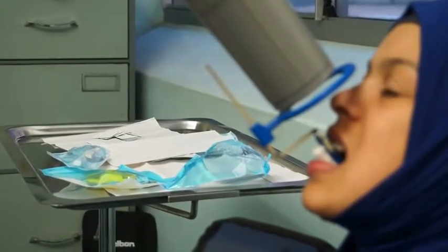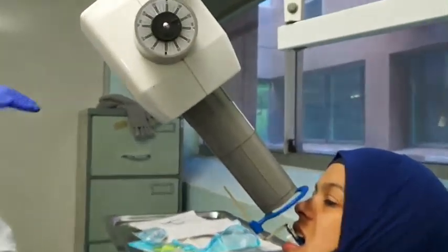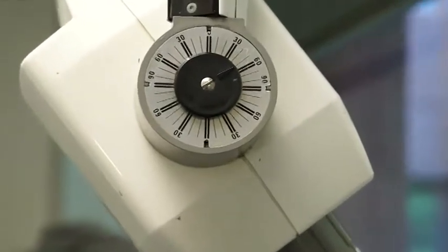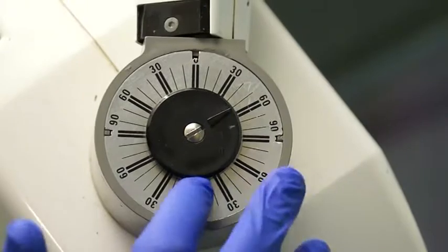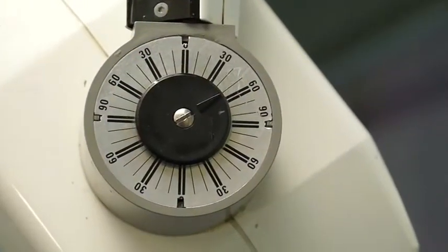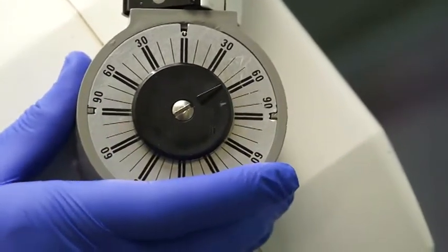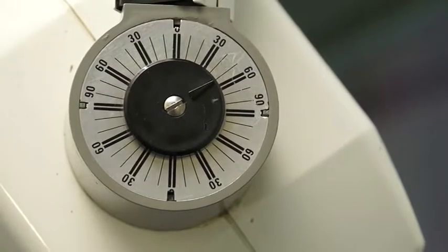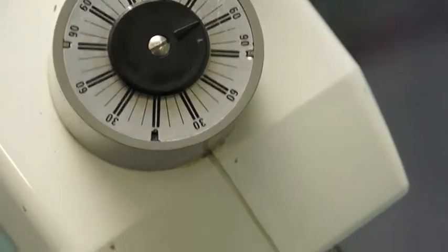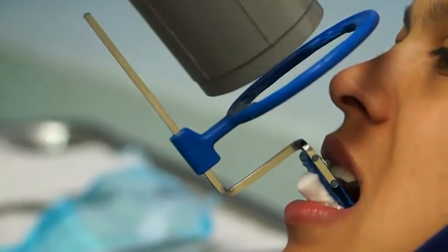As you can see, if we do the maxillary region your tube is facing down, so we call it a positive vertical angulation. You can see the angles on the side facing down, confirming positive vertical angulation. You always stand in front of your tube and make sure your horizontal angulation has the ray perpendicular to your film or perpendicular to the buccal surface of the tooth. If not, you're going to get overlapping of the teeth.